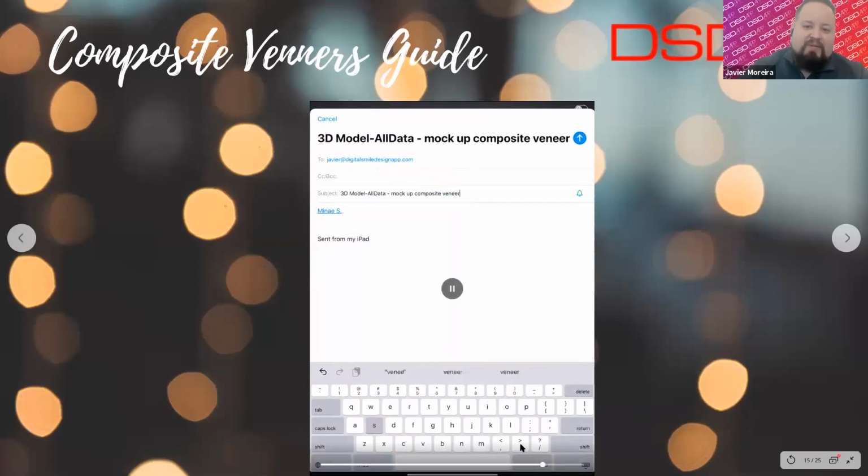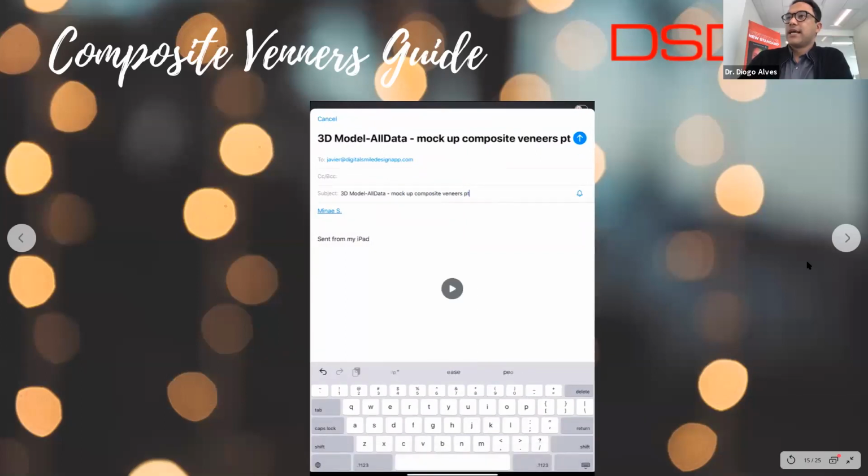Probably gonna have to turn off my background. And then once you're done with that, you save it on a cloud.